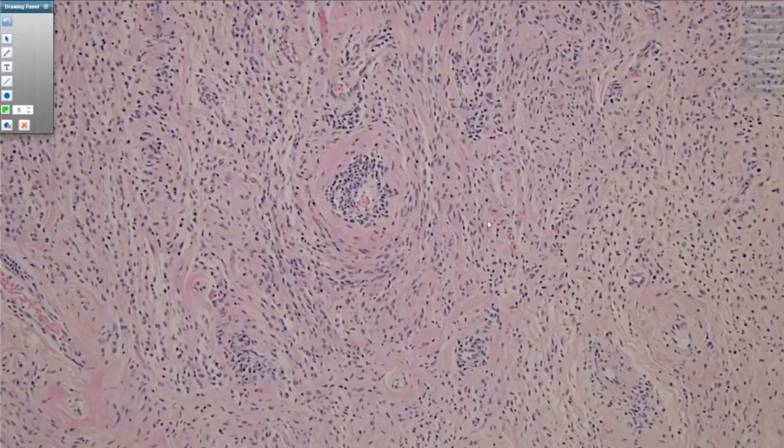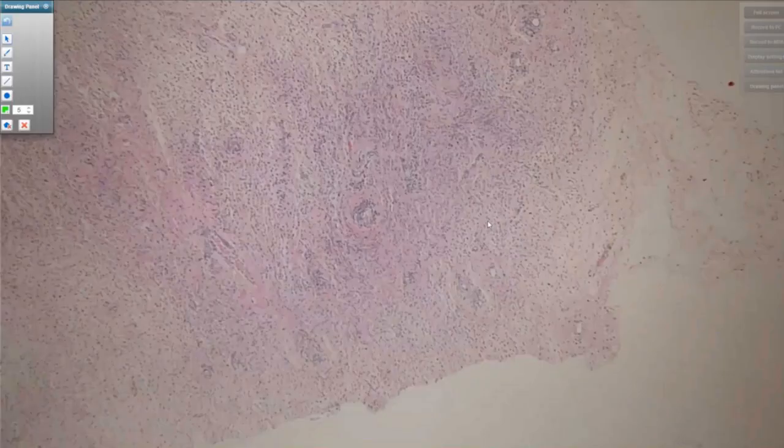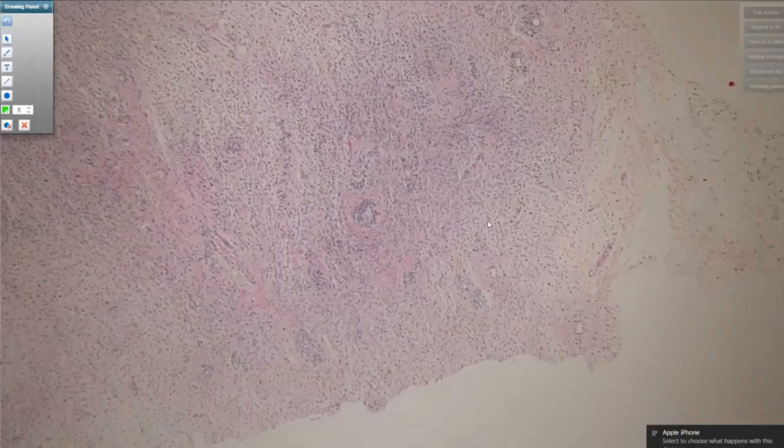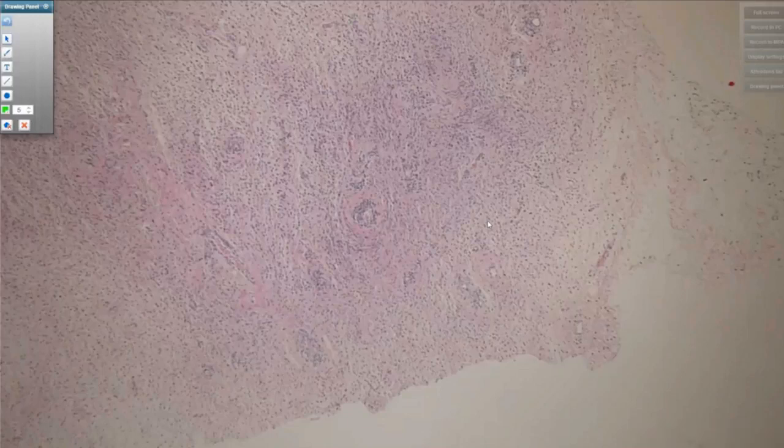As soon as you see a core biopsy like this, we think, okay, make sure it's not metaplastic carcinoma. Is it a fibromatosis? Well, the nuclei and the blood vessels aren't quite right. Could it be a myofibroblastoma, given that that's the spindle cell lesion of the breast? And bring into your differential a peripheral nerve sheath tumor. They're rare in the breast, but they certainly do occur, both in the breast parenchyma as well as along the chest wall or in the axilla. They occur in both men and females.